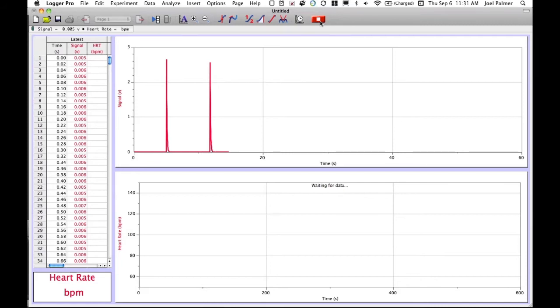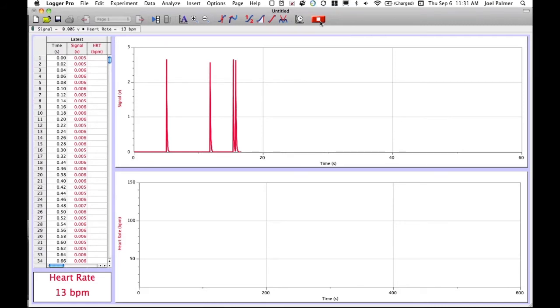I found earlier today that if my hands are not moist it doesn't pick up real well. I'm having a little problem getting it to read right now. You may want to have the students wash their hands before they try to do this so that there's some moisture on their hands.